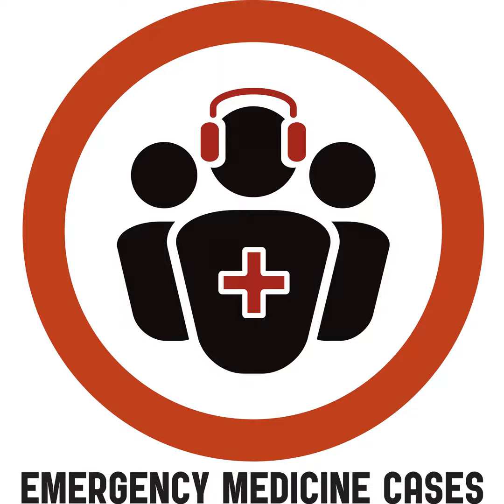So on a busy call shift where there's only 2 ultrasound technologists who are doing all the scans, there's a very good chance that the person scanning may not have that much experience in MSK ultrasound. And MSK, with the minutia of the anatomy, which is just exquisite, you need that experience. So I would say I agree with Dale in that shoulder ultrasound, routine ultrasound, if you're looking for a rotator cuff tear, even biceps long head tear, I don't think it has value when you're ordering it from the Emerge. You need to know who's going to be performing the test. And it is a general skill set in radiology. Some groups will have an arrangement such that it's their MSK experienced radiologists or fellowship trained radiologists who will be reading most of that.